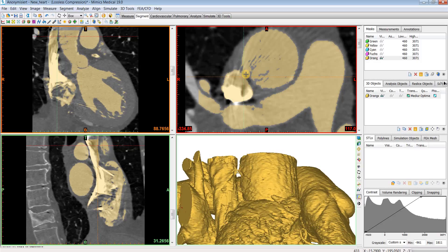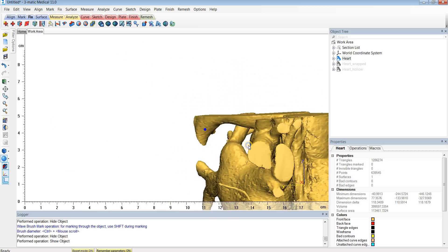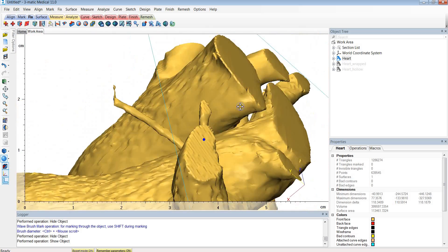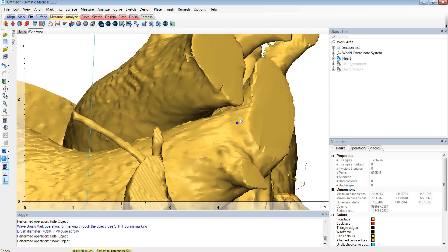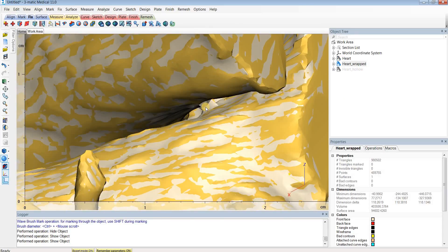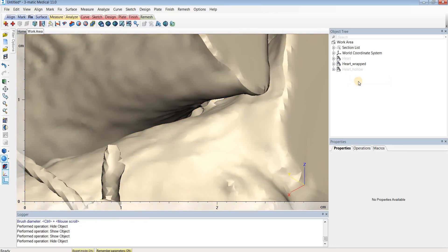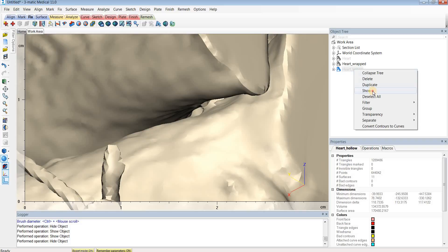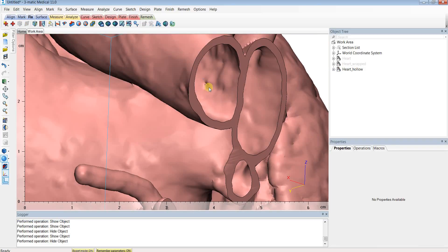The second and less obvious cause is the WRAP operation. If we go back to 3MATIC and look at our 3D model prior to the WRAP operation, you'll see there's no connection between the pulmonary artery and pulmonary vein. But when we turn on the WRAP model, you'll see a connection now exists between them, and that connection caused the hole you see in the hollow model.